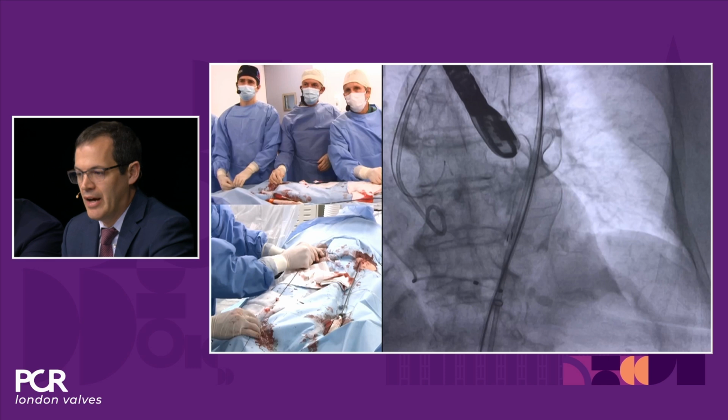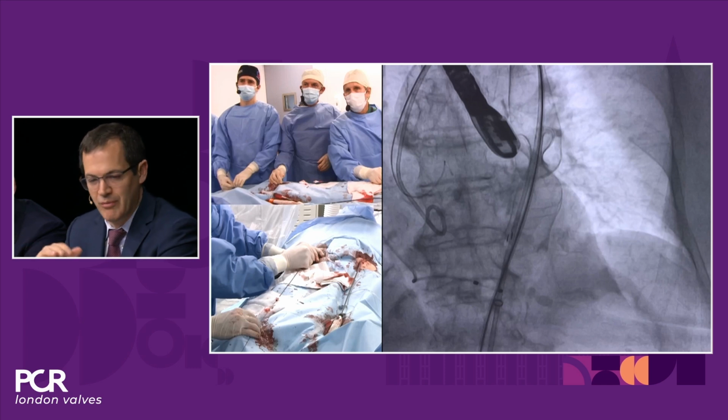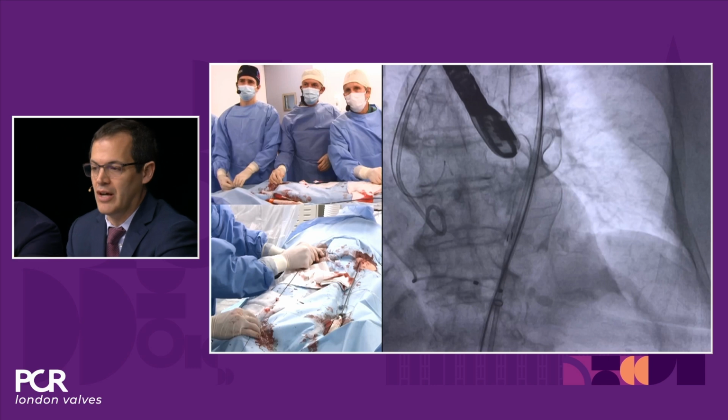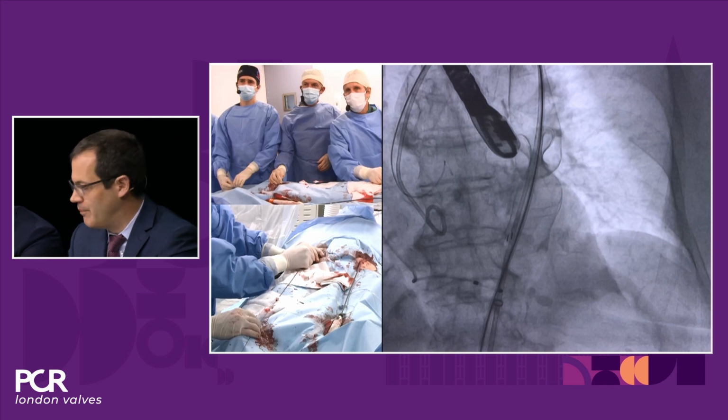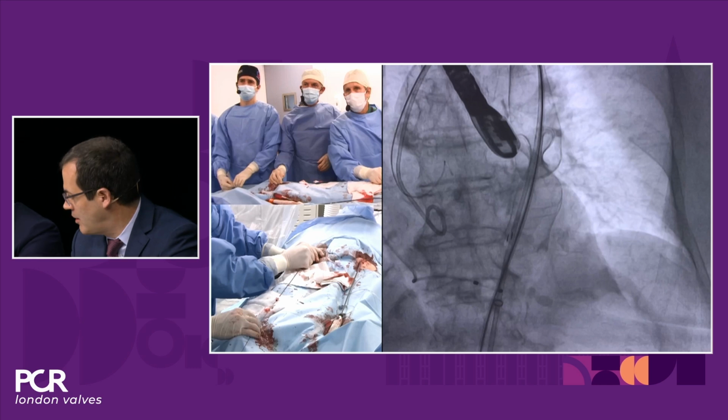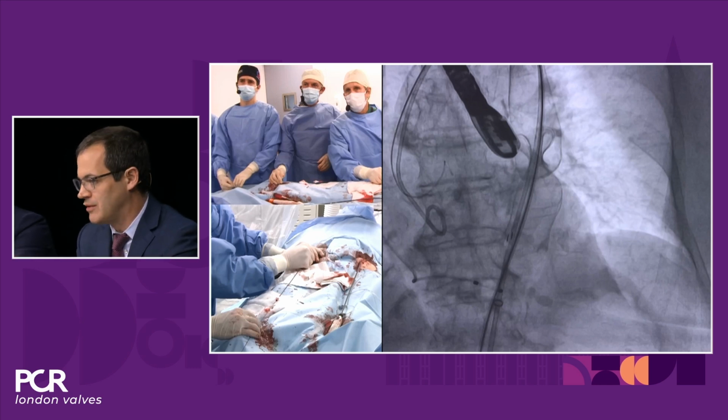It's really nice to me in a way that you don't have to spend much time trying to figure out the positioning. It's not finicky. You sort of just start near the STJ and very simply deploy it. The port then forms, and you see that it's nicely visible, and how easy it is to tell, as you nicely showed with the pigtail, that you're actually central inside of the filter. Any comments from the others that have experience using the device? What does it feel like in your hands, or how does it feel doing this deployment?